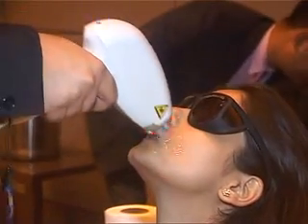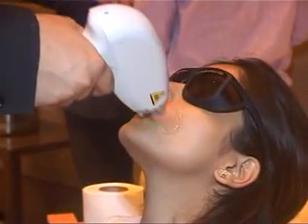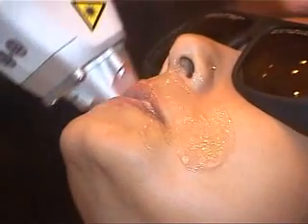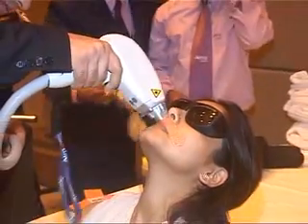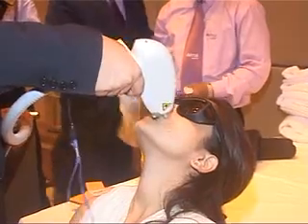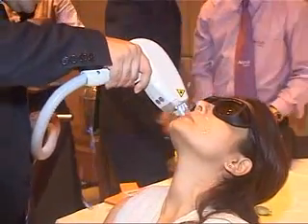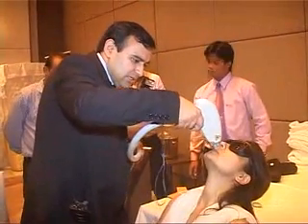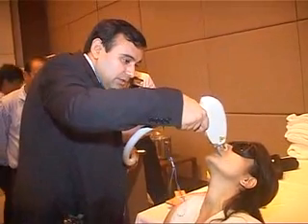5 pulses per second. You can keep alternating between the areas. If it is too warm I can reduce the intensity. If you do the stack mode, you have to slightly increase the amount of energy you are delivering, because when the machine is off some of the heat is dissipated. Ideally you can put a wet cotton strip between the applicators to make it more comfortable, and keep replenishing cold gel in the middle.